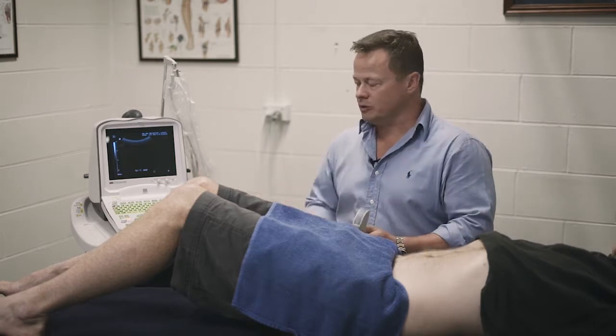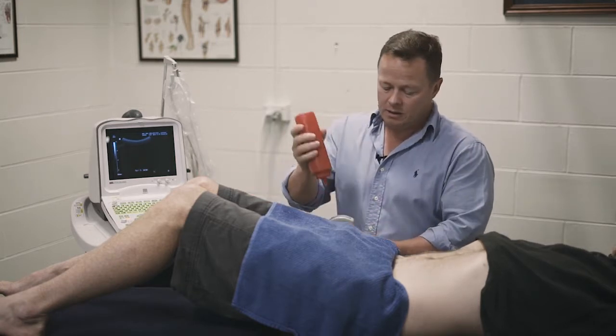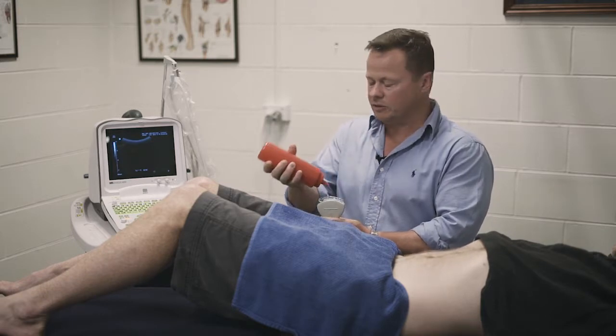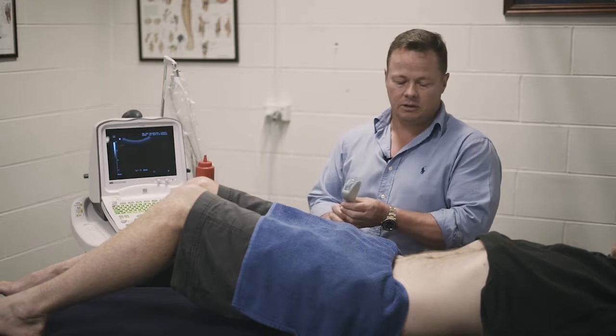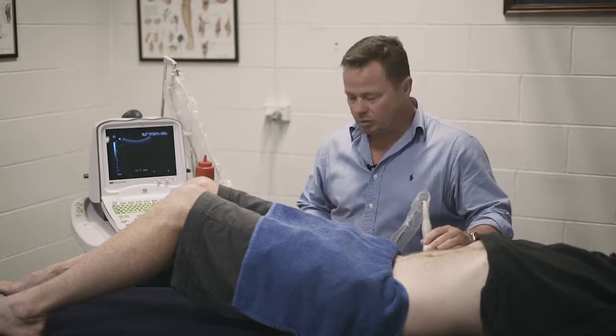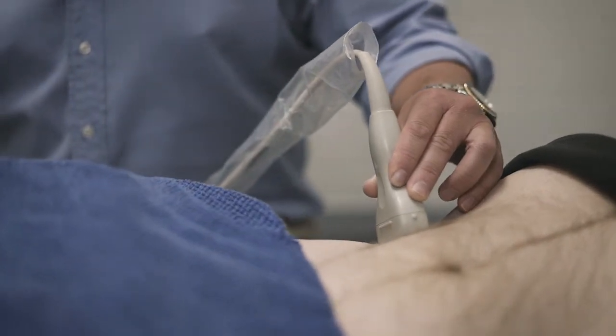We place some ultrasound gel on the head of the ultrasound machine, which allows the sound waves to be conducted through the gel and onto the corresponding tissue. I'm going to place it onto the abdominal wall here.